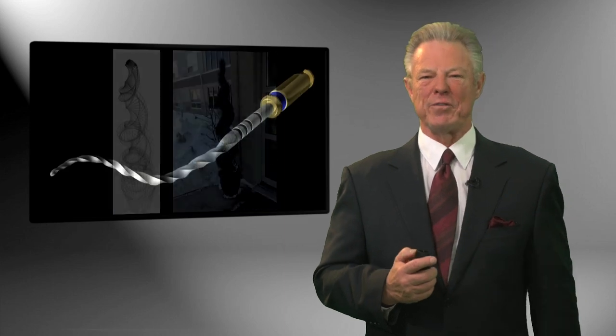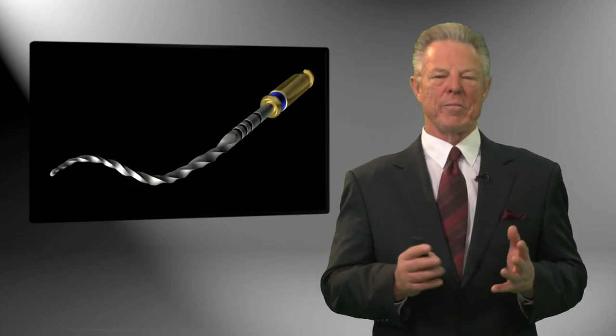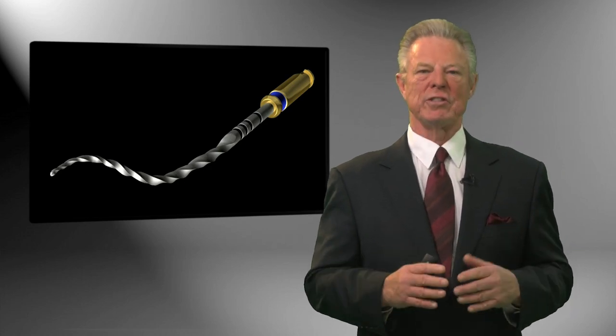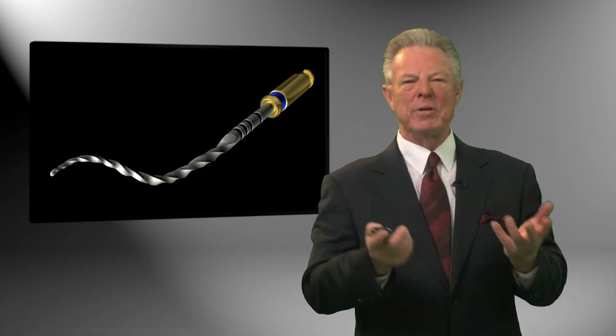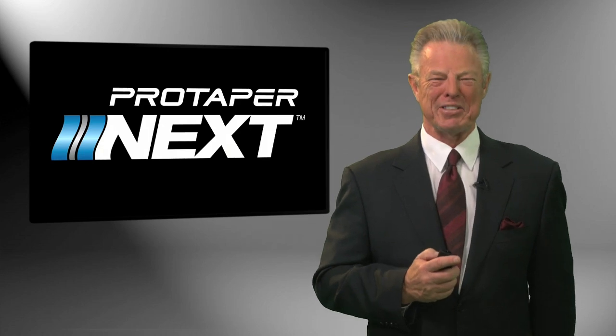So I thought that was fun. When we originally made ProTaper, quite honestly, if you remember some of those early animations, it showed one curve. And now we've got multiple curves because they are slinky. They are able to follow because of a couple of reasons that I'm going to talk about next.